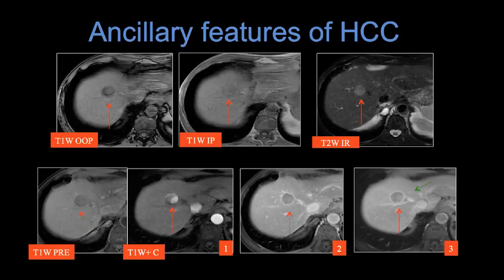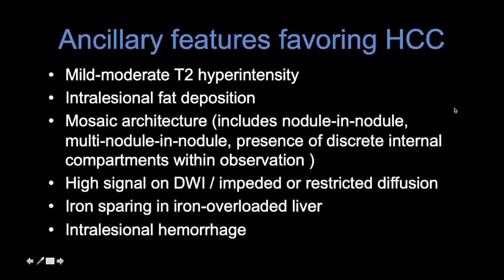When looking at these patients, we're also looking for ancillary features. On T1-weighted in-phase versus out-of-phase images, we can see loss of signal indicating intralesional fat. This has increased signal intensity on T2-weighted images — another ancillary feature of HCC. Other ancillary features include: mild T2 hyperintensity (compare it to the spleen — the whiteness of spleen, not CSF), intralesional fat, mosaic architecture, high signal intensity on high B-value diffusion or restricted diffusion on ADC maps, iron sparing in an iron-overloaded liver, and intralesional hemorrhage. All of those will lead you to the site of HCC.